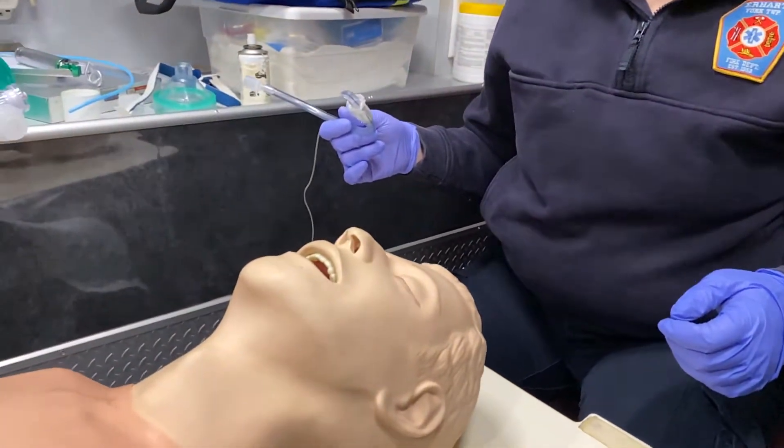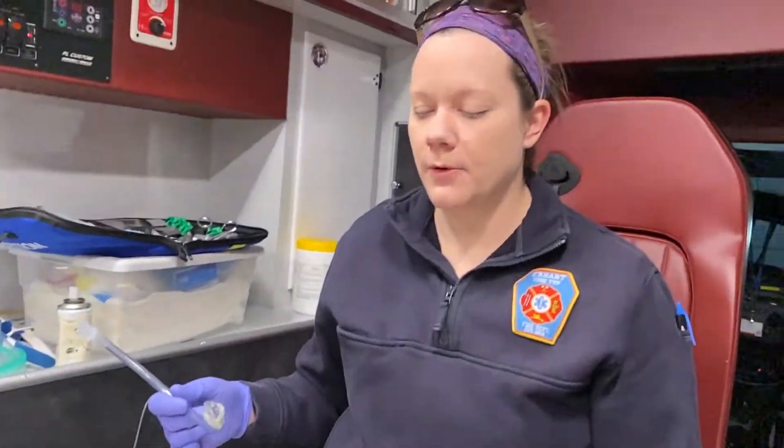The next form of intubation that we're going to look at is called nasotracheal intubation. This is a very rare form of intubation that we use mostly in trauma.